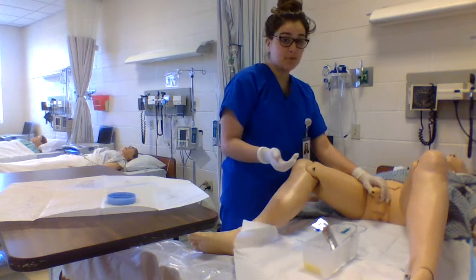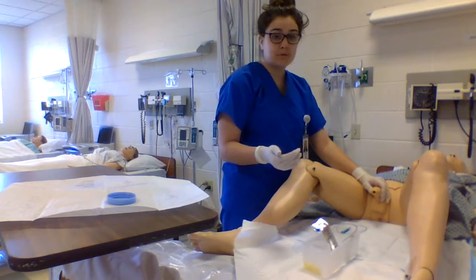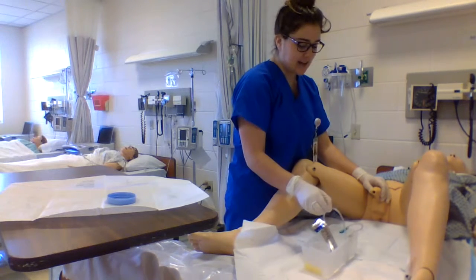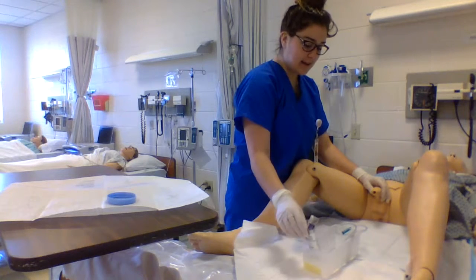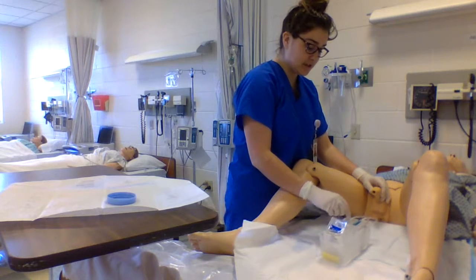And so like I said, I already performed perineal care, but it's important that you clean it really well so you prevent urinary tract infections, anything like that. Because the catheter goes up into the bladder and it can contaminate if you're not sterile. So that's why this needs to be a sterile procedure.